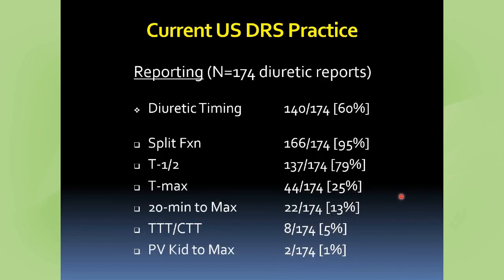So last topic I'm going to touch on briefly is reporting. Where are we putting our reports? Well, you can see here, diuretic timing, when we gave the Lasix. Out of the 174 diuretic reports we had, only 60% of us were documenting when we gave the Lasix. Did we give it 15 minutes ahead of time? Did we give it 20 minutes after? Did we give it when collecting system visualized? And that's very important information.